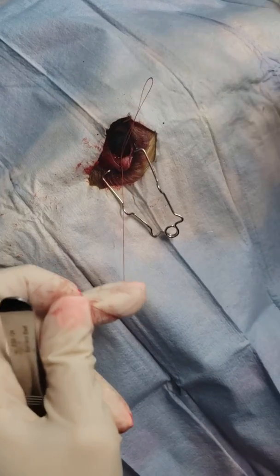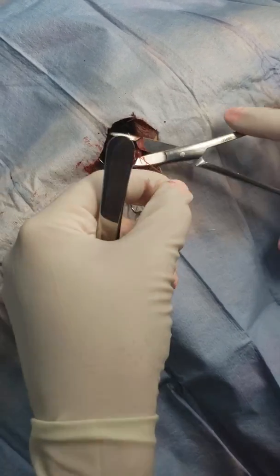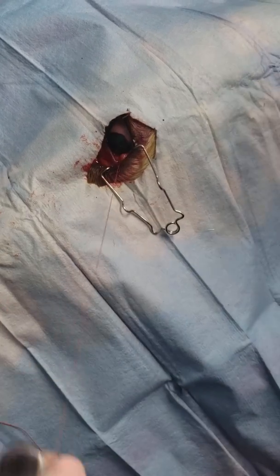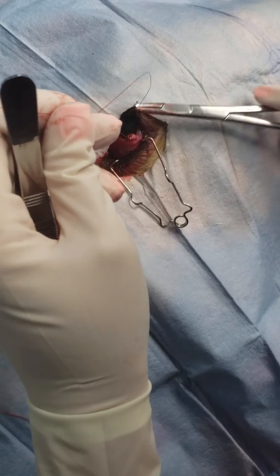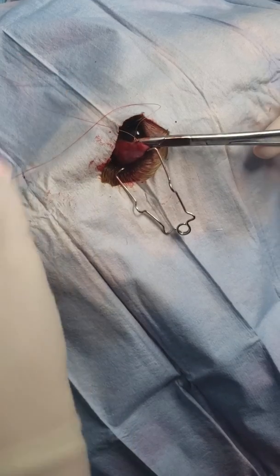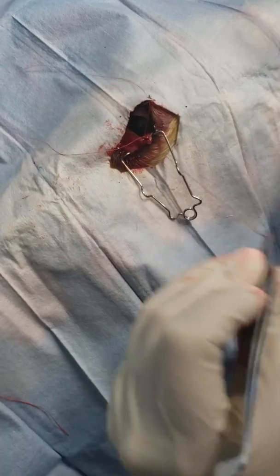Four or five throws. Keep that knot small. Then you come as close to that knot as possible to sink it down and bury it.